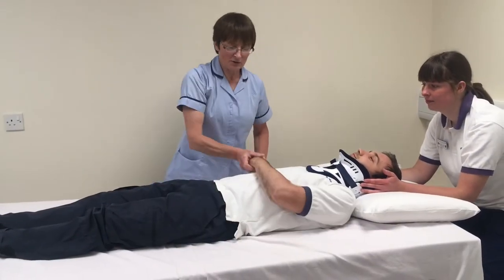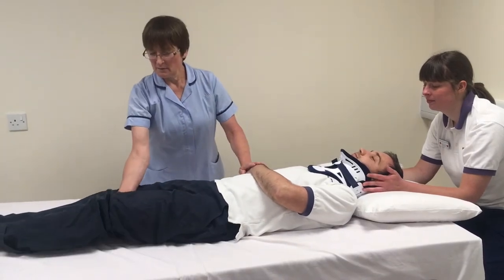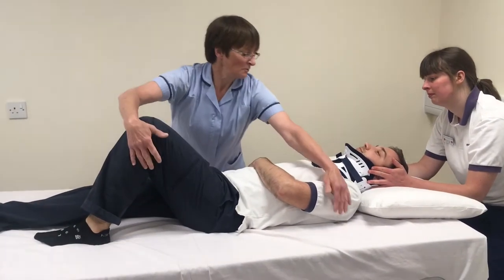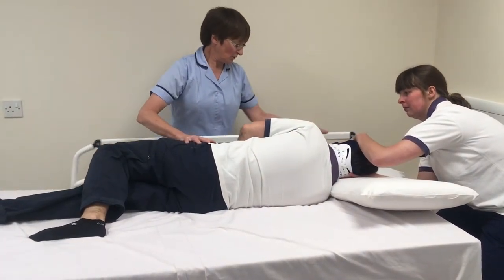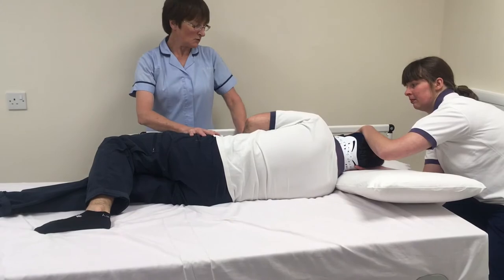We'll bring one arm across the tummy, bend up one knee, and ask your patient to roll towards you. At this point you can use the bed rail to give them some confidence.